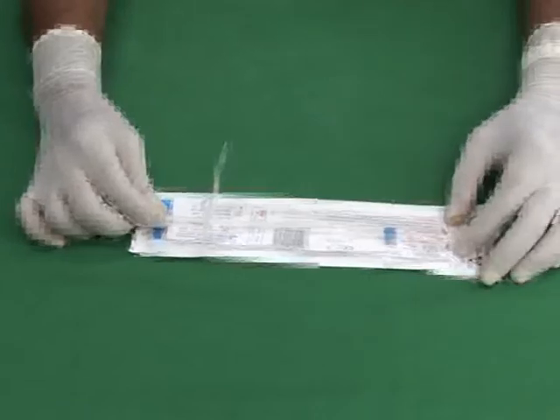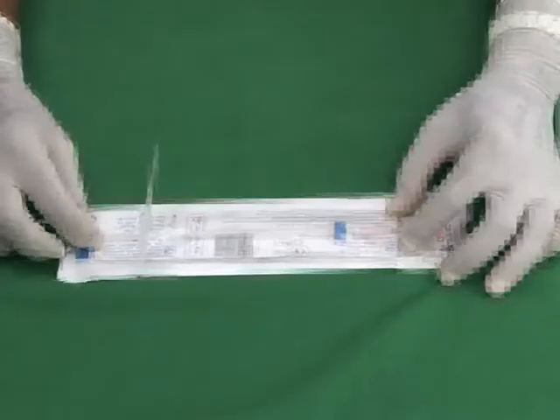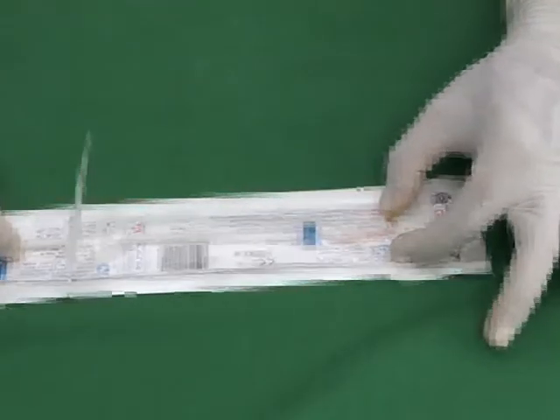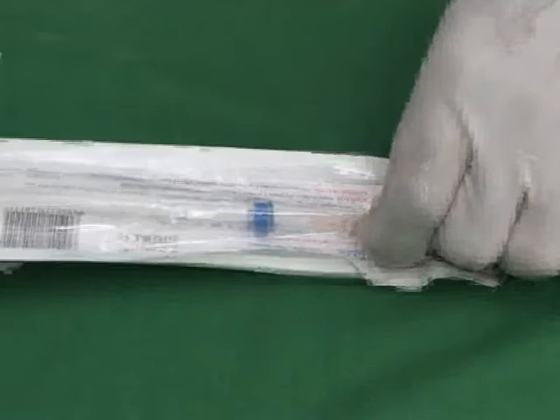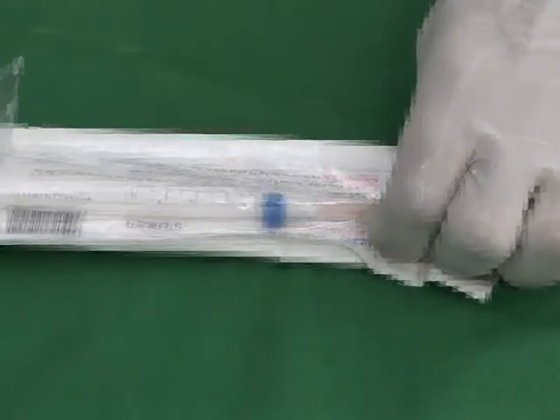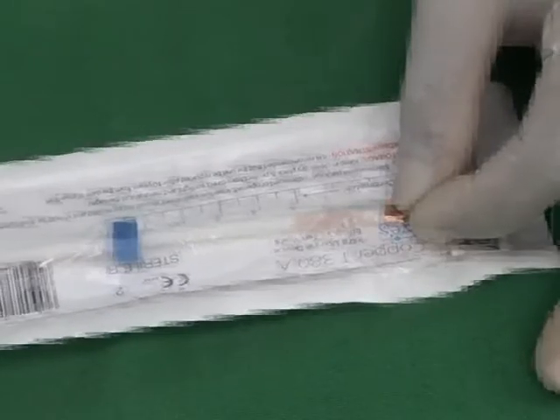The next step is to put the horizontal arms into the outer tube. You need to hold the end of the horizontal arms and bend them downwards so that the two arms are pushed inside the outer tube. Now you see the horizontal arms are pushed inside the outer tube.